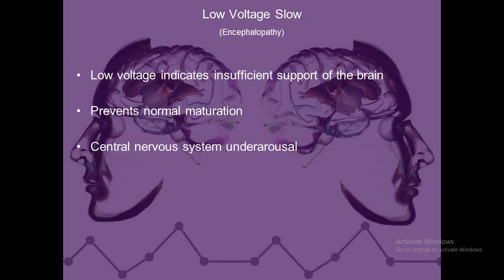The next one is a low voltage slow encephalopathy. This is something that doesn't show up very well on brain maps. It's just the way it is. It just doesn't produce the same effect. You can see excessive delta, but what does that tell you? The person who needs to diagnose encephalopathy will have to be an electroencephalographer. We can't do that, not as MDs or PhDs or therapists.